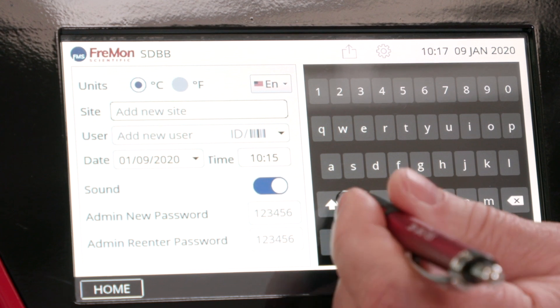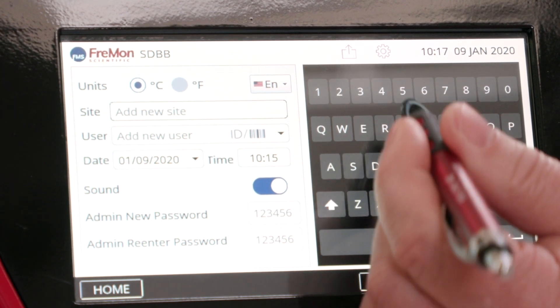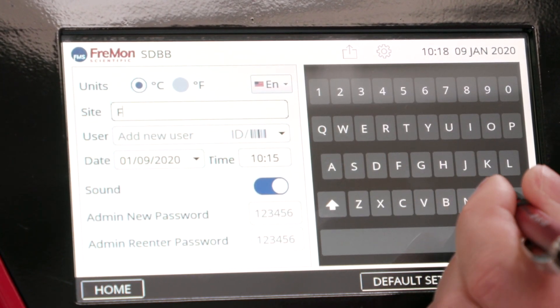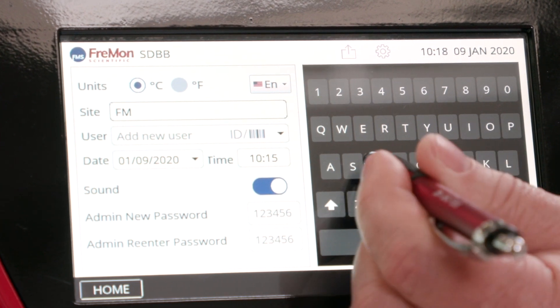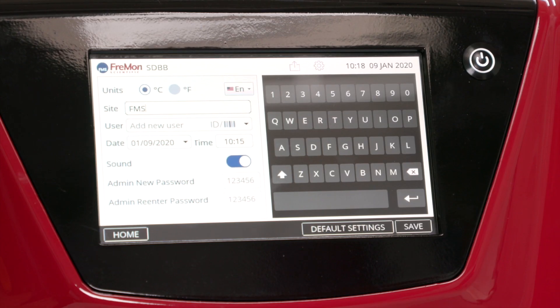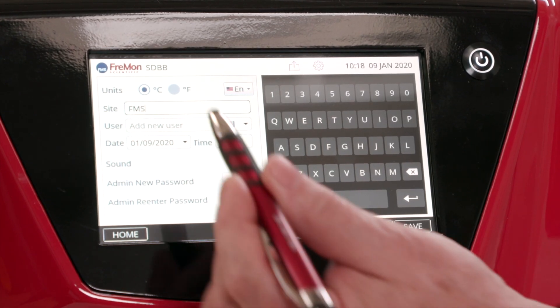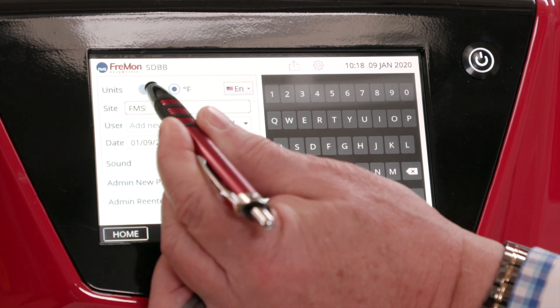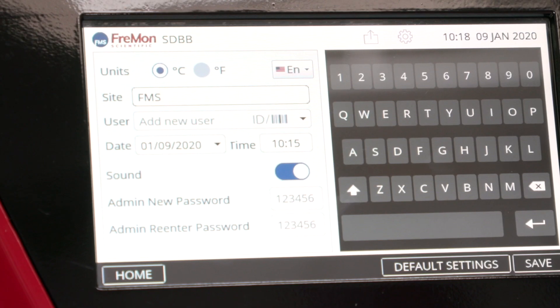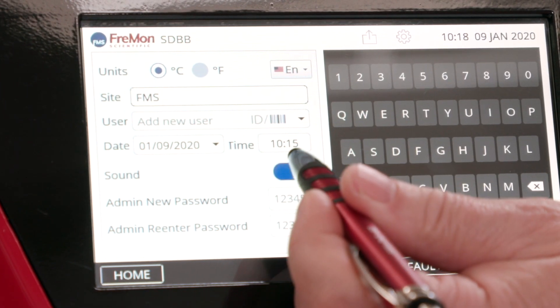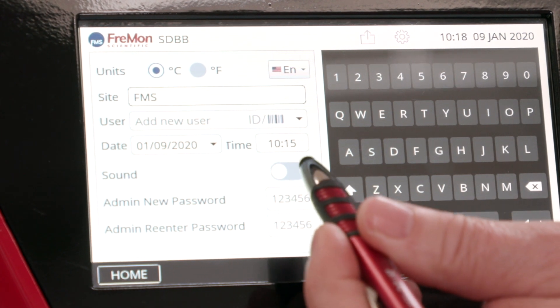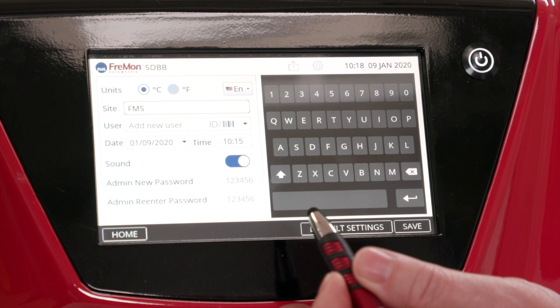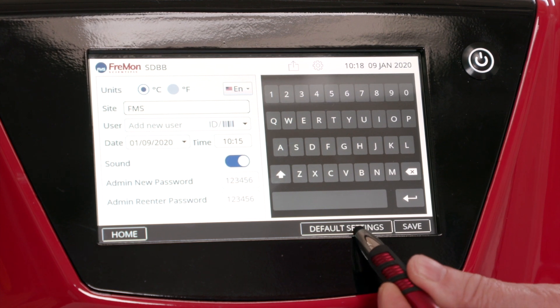Enter the site name — we'll type in FMS for demonstration purposes. Set temperature units to Celsius or Fahrenheit. Turn the audio on or off. You can also revert to device default settings.